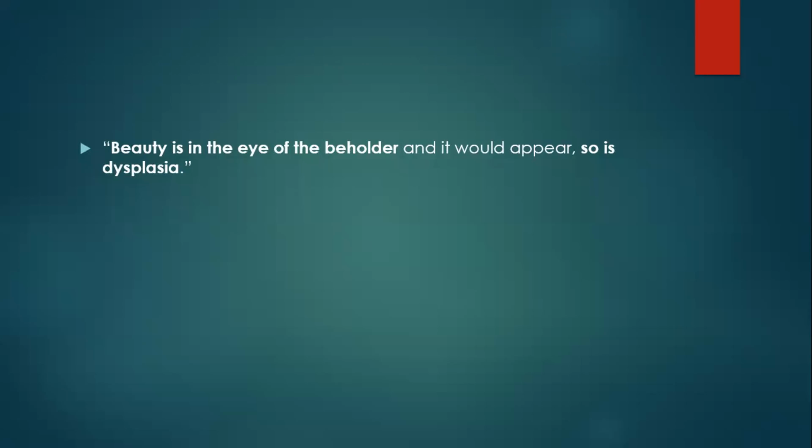So unfortunately, my endoscope does not have that suctioning apparatus, but I have to tell you that it's better to go with a suctioning apparatus. That will take away those secretions and give you a better feel. Also, you'll be able to give 4% xylocaine better if you have a biopsy channel or a suction channel, and you can go closer to the lesion. 0.5 centimeter is what is recommended.